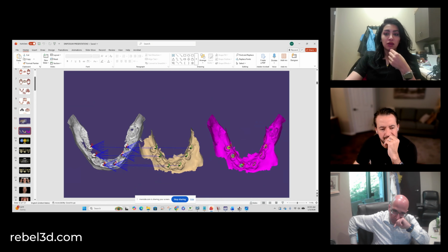Not to mention the deflection that happens in the horseshoe shape of the mandible. So here, what I'm doing is that segmented jaw that I was talking about, how I'm merging the intraoral STL scan to it. When I'm doing the merge, this rainbow map is showing you a really accurate merge, versus this side that shows all in purple, which tells me that there is some sort of an inaccuracy in the mesh. So my intraoral scan is not completely lining up to the CT scan.